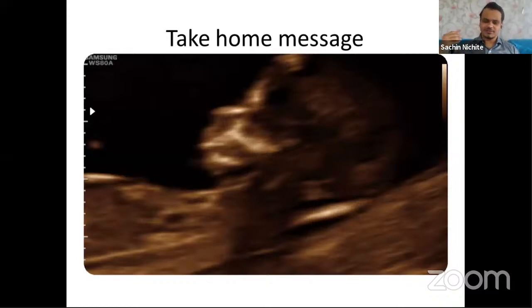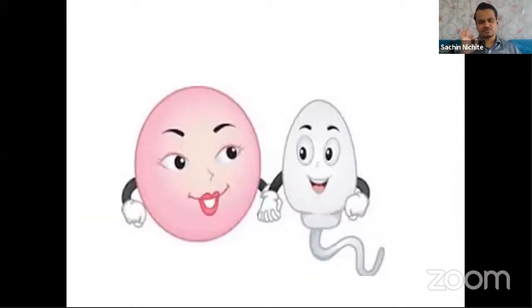We have to develop a lot of patience, a lot of dedication and passion for the profession. Then only each and every NT image will be like this, approximately like this, to fulfill the FMF criteria. Thank you so much.